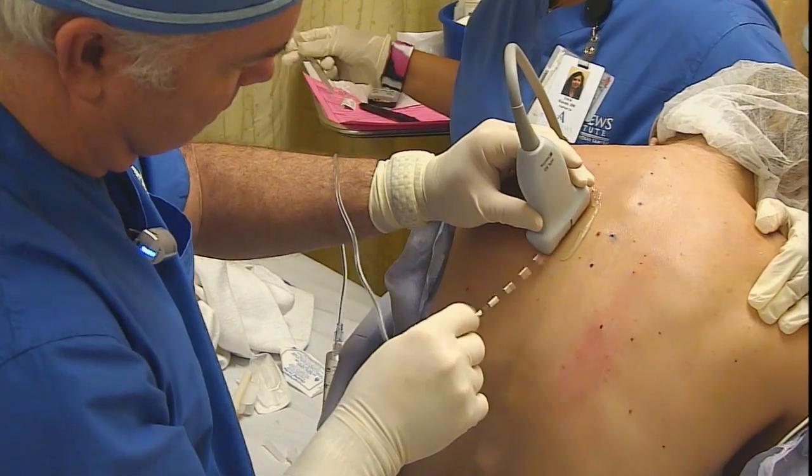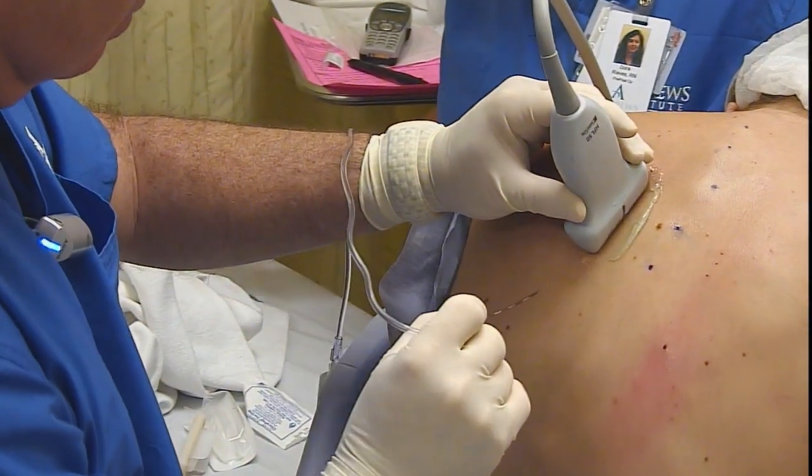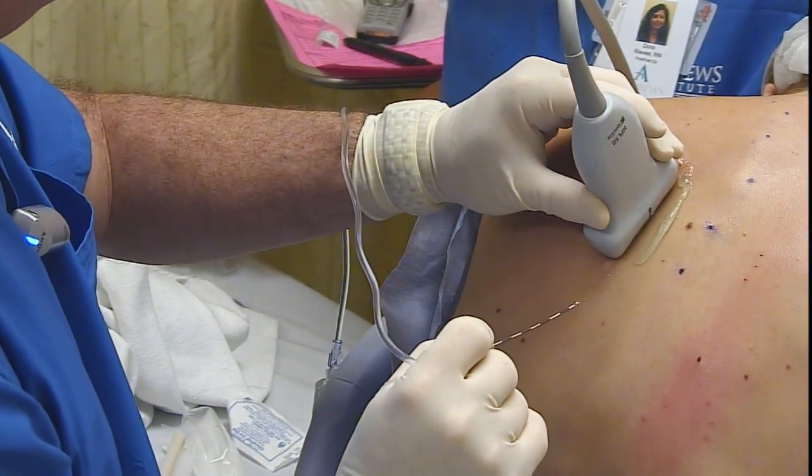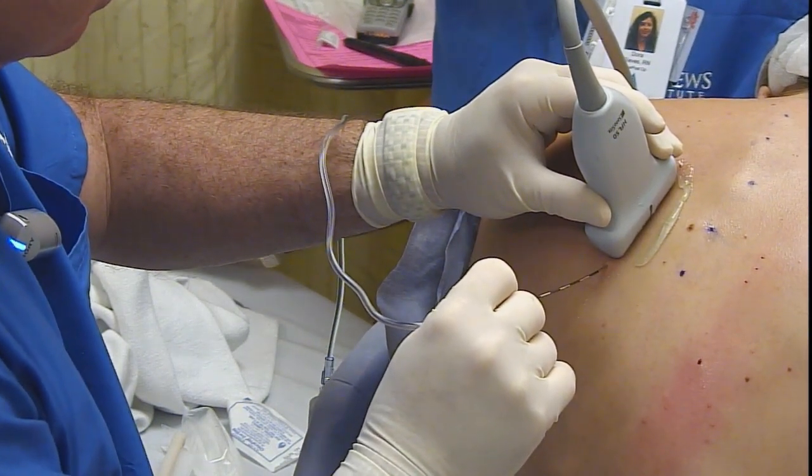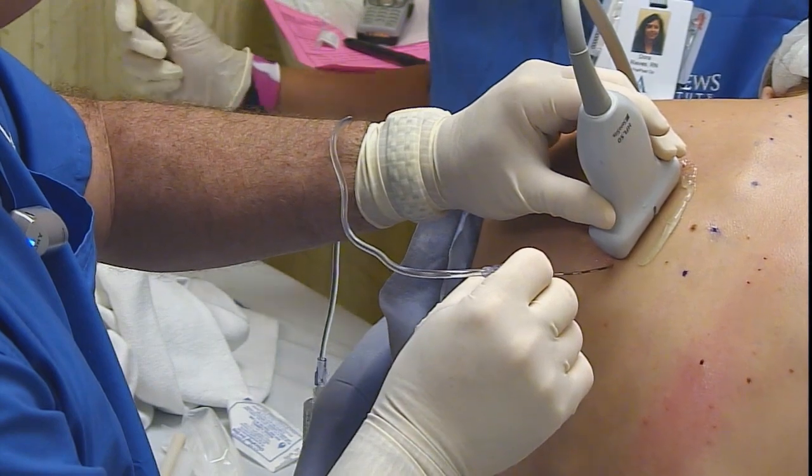With this very steep angle, it's very difficult to see your needle. So echogenic properties are very important in your needle to be able to see it as it approaches the transverse processes and the pleura.